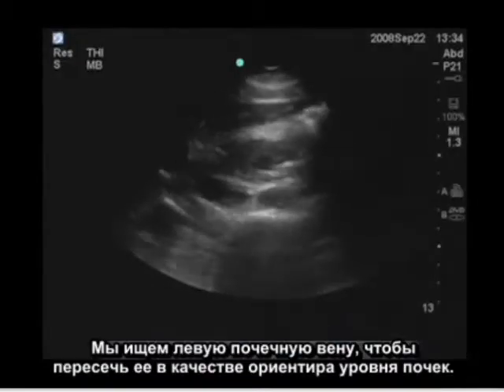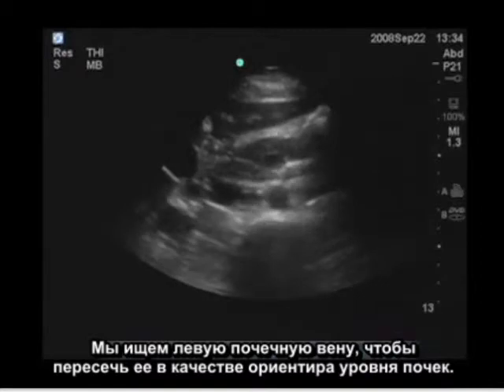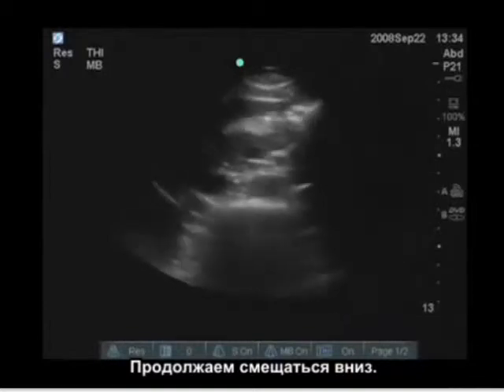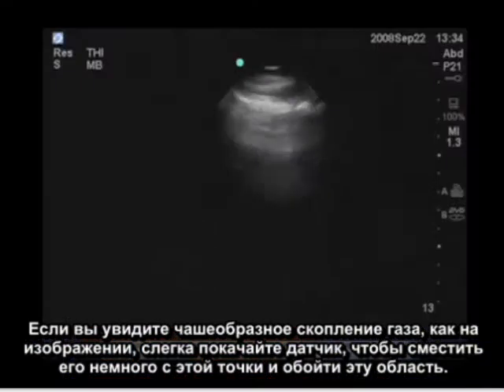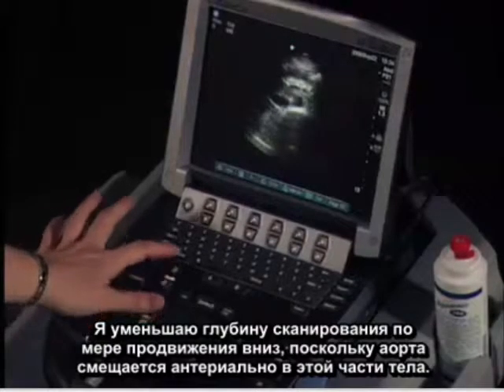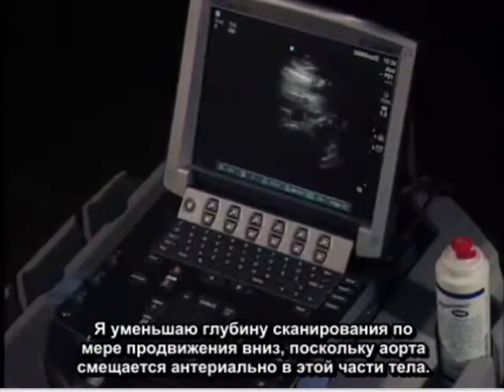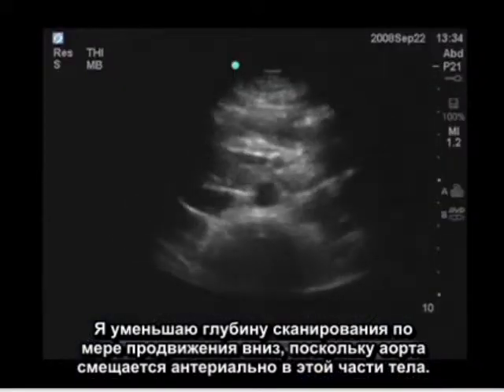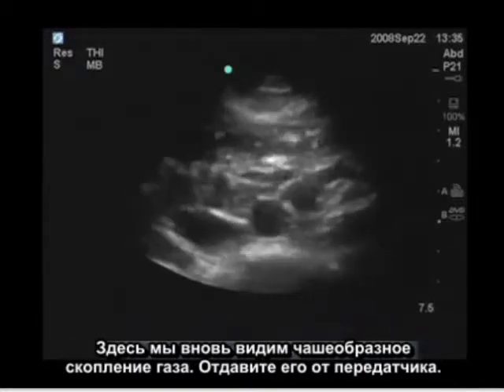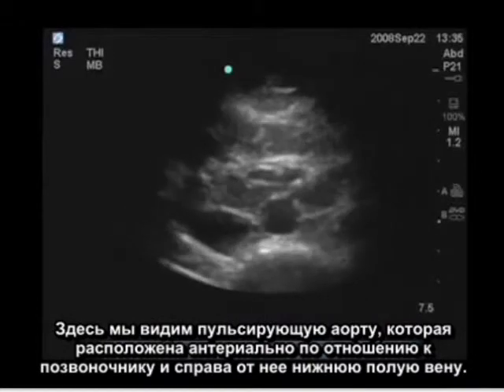From this point we're going to move down. We're looking for the left renal vein to cross over as our landmark for the renal level, and we're going to continue moving inferiorly. If you see bowel gas, just wiggle the transducer a little bit to push it out of the way and work around it. I'm going to decrease my depth as I move inferior because the aorta moves anterior in the body, and here's the aorta pulsating, sitting anterior to the spine with the IVC to the right.